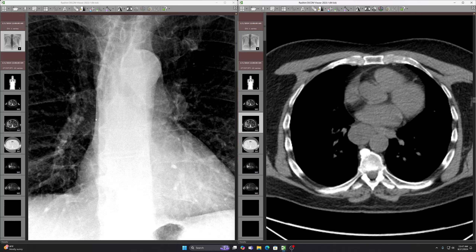Now you might ask why isn't this a spinal mass? Well, the paraspinal lines are lateral to it — this is the right paraspinal line right here, and that's in normal position. And the other thing is, if you follow this line medially as you go down, it's superimposed over the spine. So that's why this can't be a spinal mass.